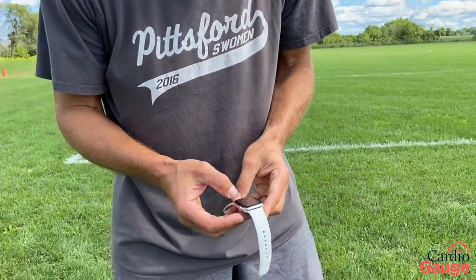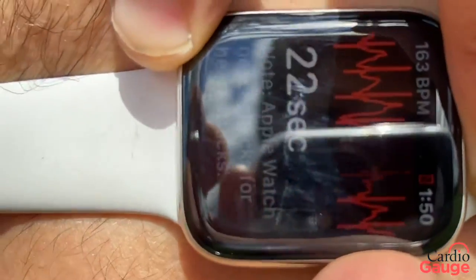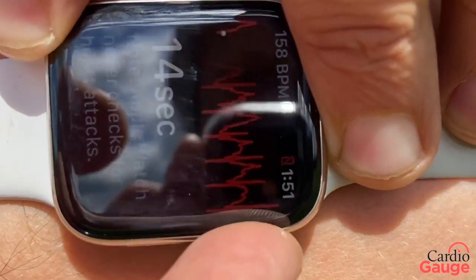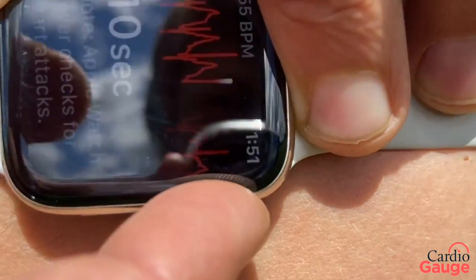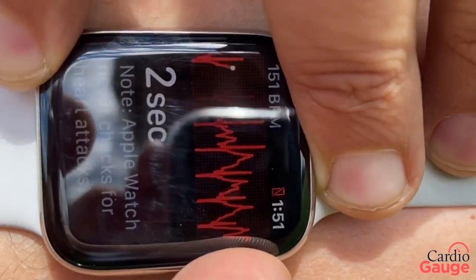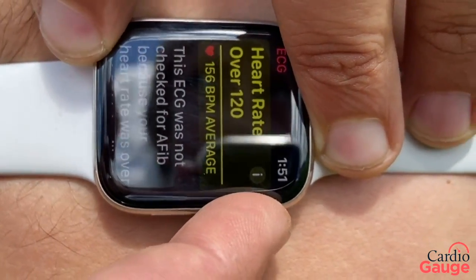Okay, it's EKG time. I'm shooting for 85% of my maximum heart rate, which is about 145 for me — that's our usual target for a stress test. The formula is 85% of maximum predicted heart rate, which is 220 minus a person's age. So for me, 100% maximum predicted heart rate is 170 because I'm 50, and 85% of 170 is about 145.